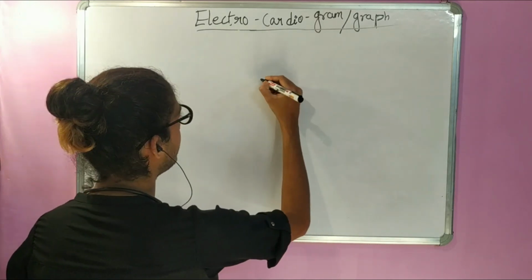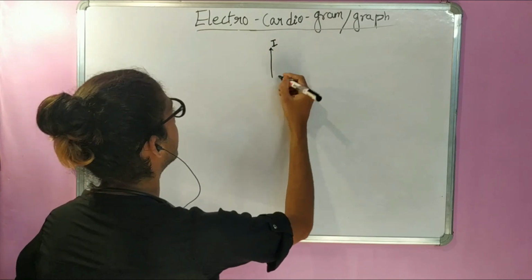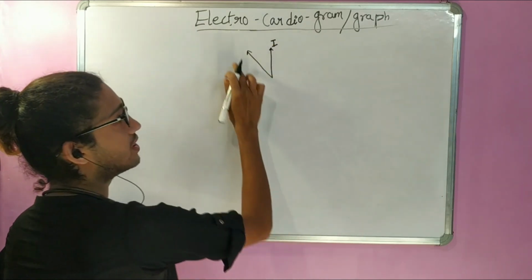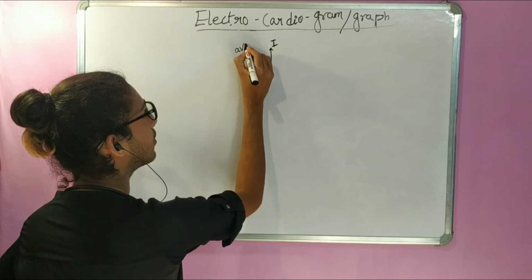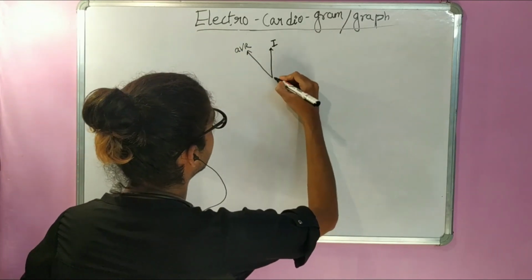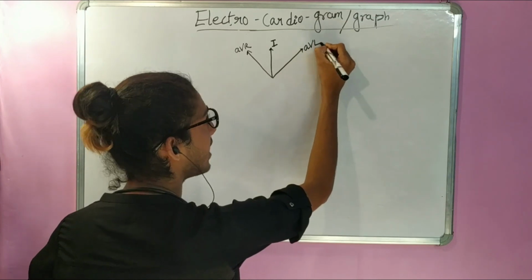Remember we studied lead 1 that gives us the view of the heart from the top. Then we studied another unipolar lead, this one here, which was on the right arm, called augmented vector right. And this one here, what we studied was augmented vector left.